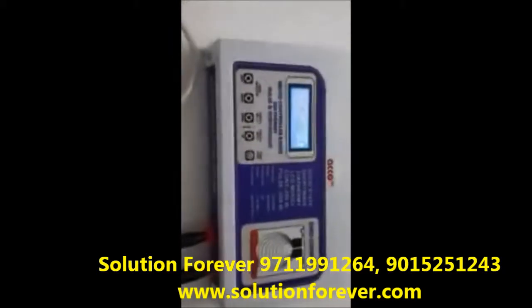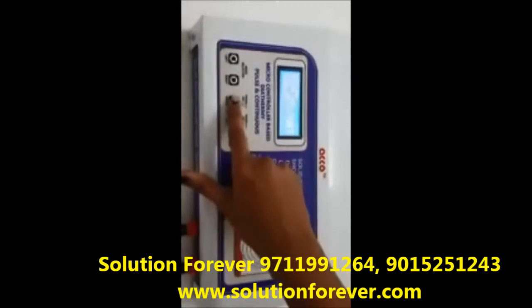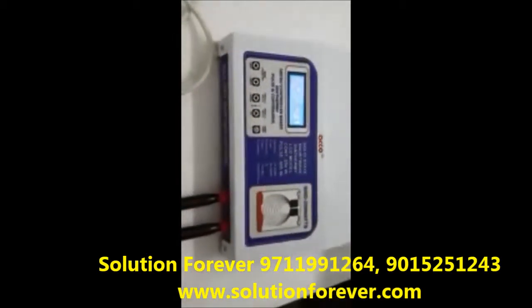The machine has 35 programs — Program 1, 2, 3, 4. After treatment is completed, switch off the machine.